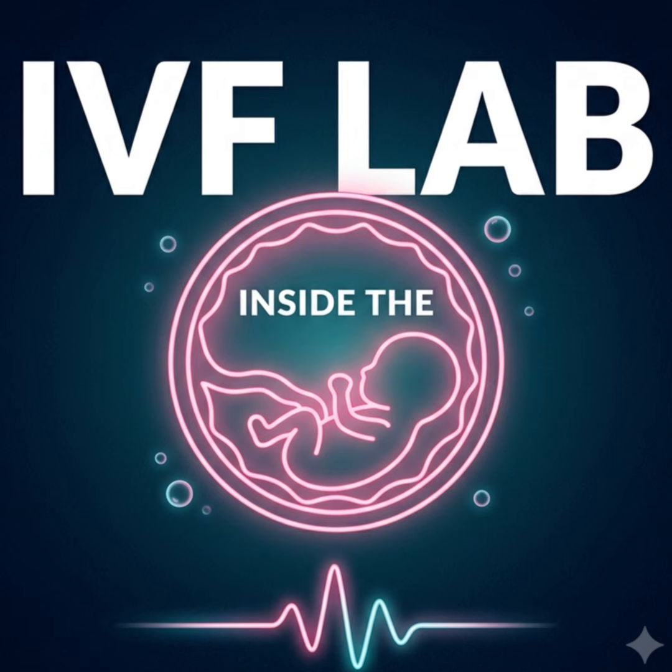Okay, that makes sense. And beyond symmetry, the embryologist is scanning for fragmentation. Let's drill down into fragmentation, because we hear that word a lot in IVF circles, but mechanically, what is actually happening there? So during cell division, the cell membrane pinches inward to separate the one cell into 2. Sometimes, instead of a clean break, tiny pieces of the cytoplasm pinch off on their own, forming little membrane-bound bubbles that contain no DNA.